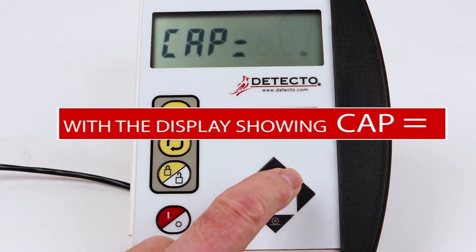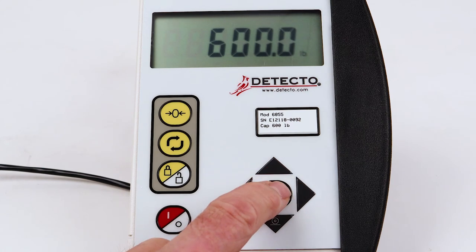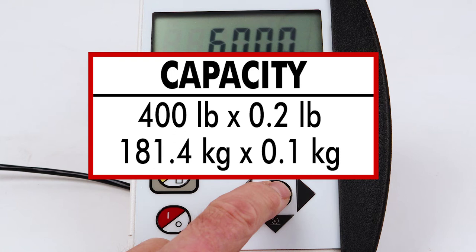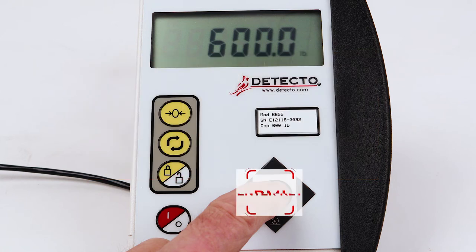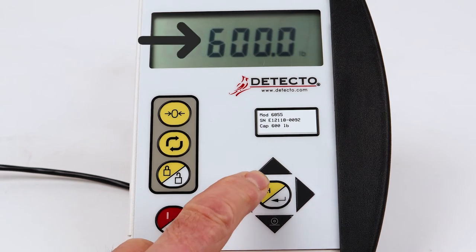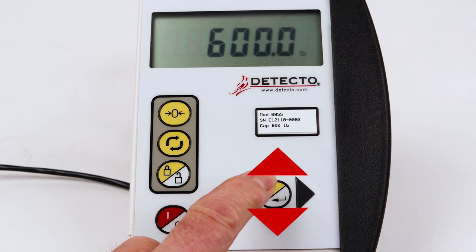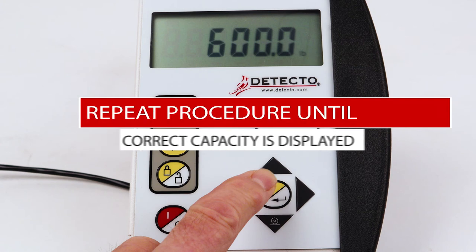With the display showing CAP equal for the capacity setting, press the BMI Enter key to show the current setting, referring to the label or serial number tag. If the setting is correct, press the BMI Enter key. Otherwise, using the arrow keys, change the setting to the correct capacity. Note that the blinking character is the position to be changed. Press the up or down arrow keys to scroll through the numbers. When the desired number is displayed, press the left arrow key to advance to the next position. Repeat this procedure until the correct capacity is displayed and press the BMI Enter key.